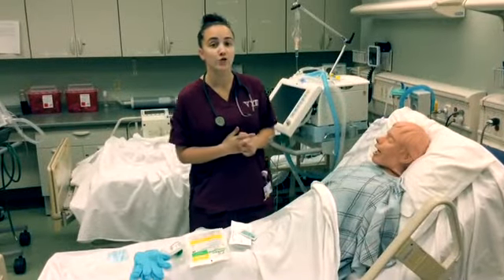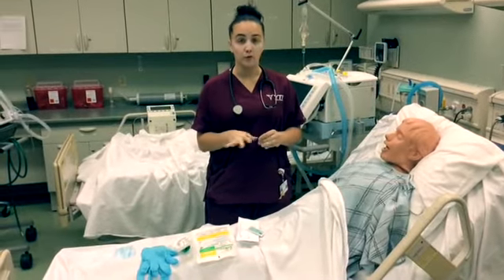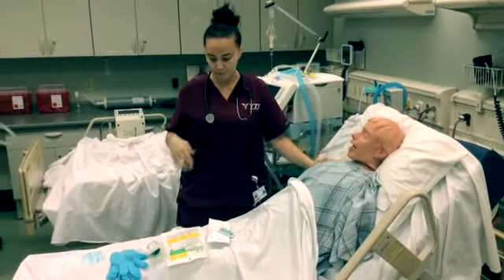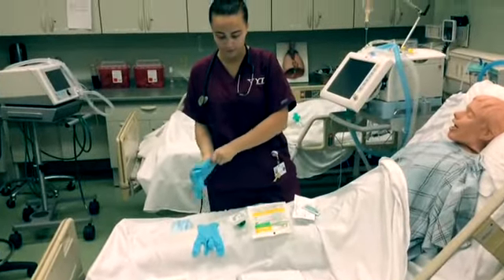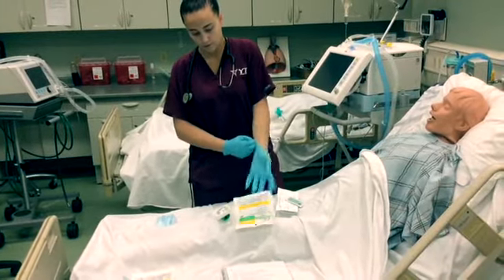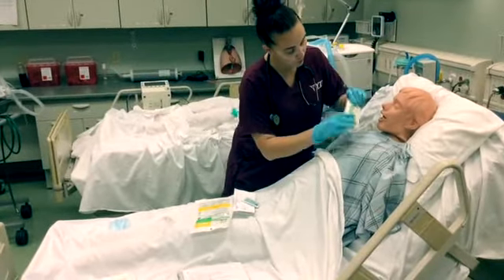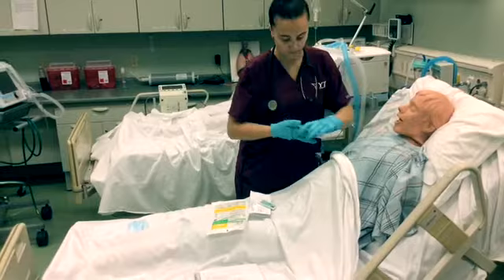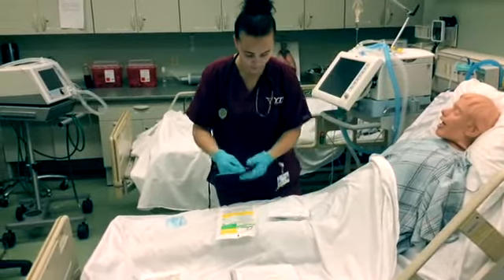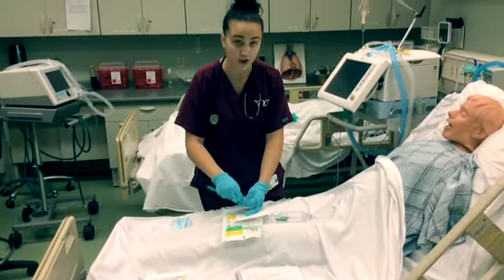Now I'm going to show you nasotracheal suctioning and open suctioning. This is a sterile procedure. You want your patient in the sitting upright position with the sniffing position. First you're going to put your gloves on. In the nasopharyngeal airway, you have to measure this. You want to go from the nose to the ear. You can open your nasotracheal suction catheter, but do not touch it. It has to be sterile.